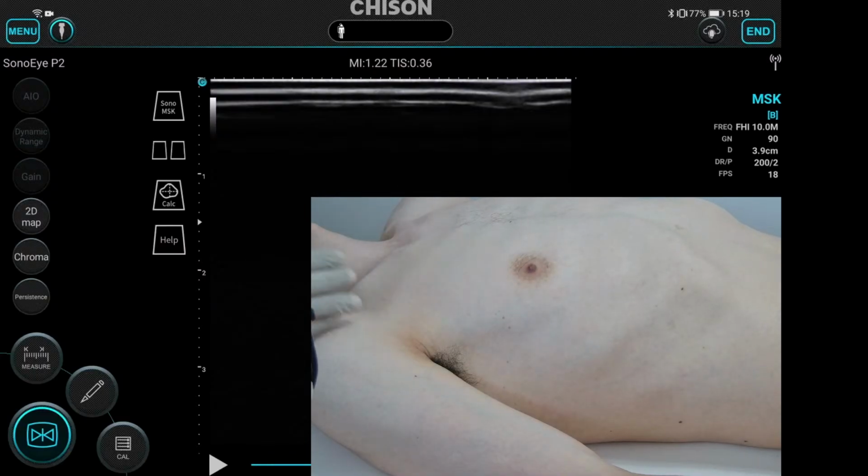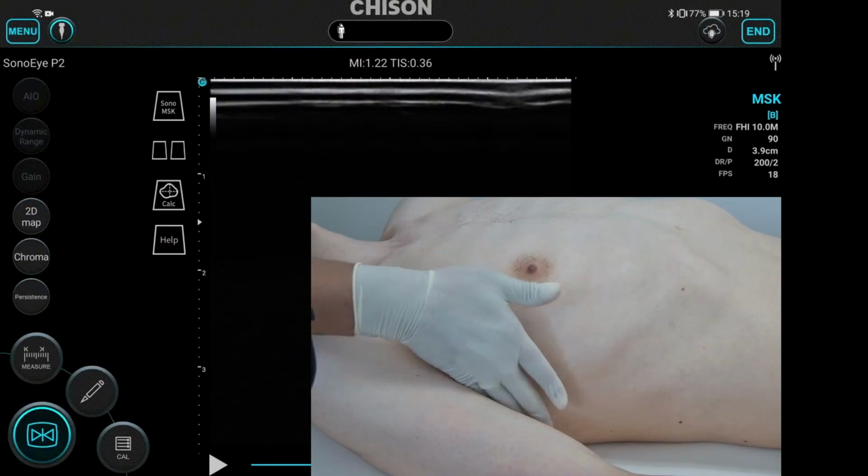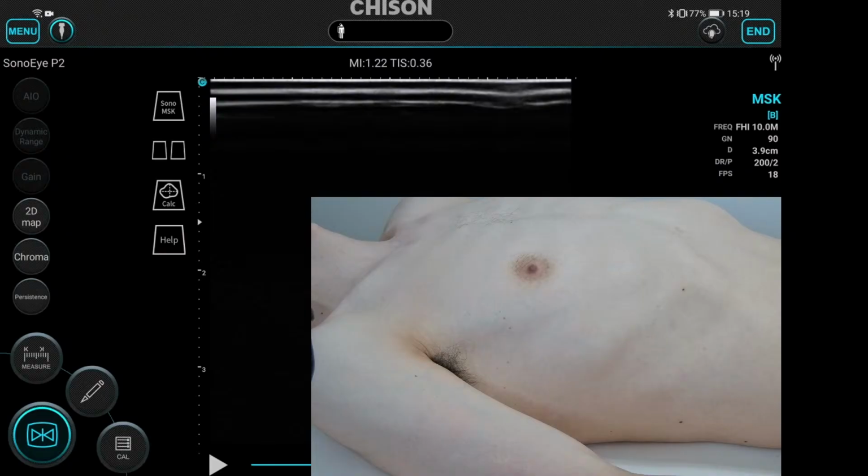And then we have the posterior side, not on the anterior, we have the posterior side, back side, where we are going to cover the erector spinae plane block. Erector spinae plane block has become very famous these days because of its simplicity. Okay, it is very easy and it is very effective. It covers the major components of chest. It provides analgesia to the posterior wall because we are targeting the thoracic spinal nerves. It also targets the lateral chest wall and anterior chest wall. So it becomes a very good block for any kind of open chest surgeries like thoracotomy.